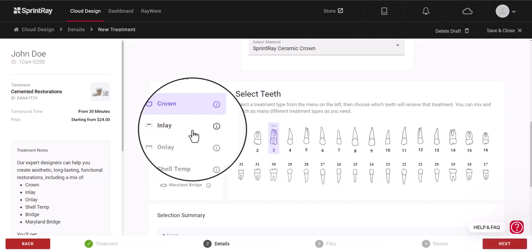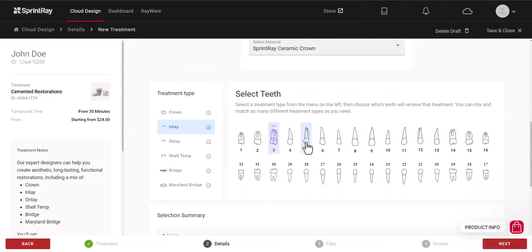Using the menu on the left, indicate the type of design you need and specify the tooth for that particular design. You can choose crown, inlay, onlay, shell temps, bridges, and Maryland bridges.